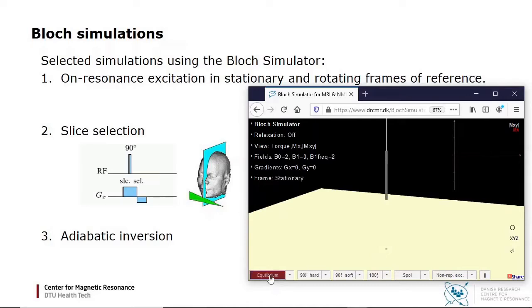Let's see how a 90 degree pulse affects the magnetization. The purple bar is the torque from the B1 field, which indicates in which direction the magnetization is pushed by the RF pulse. At resonance, these pushes consistently increase the excitation angle.